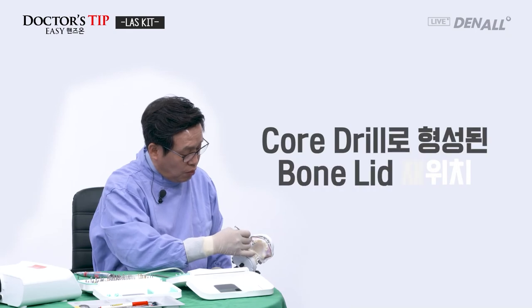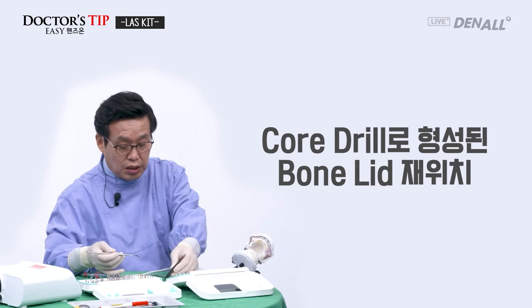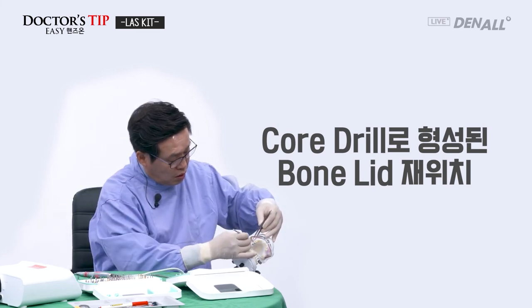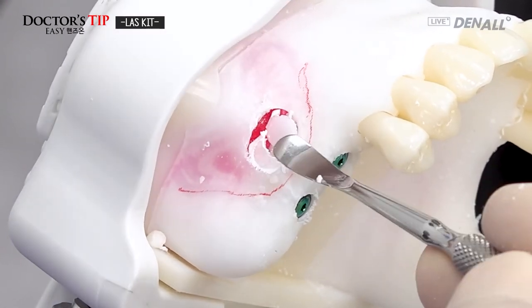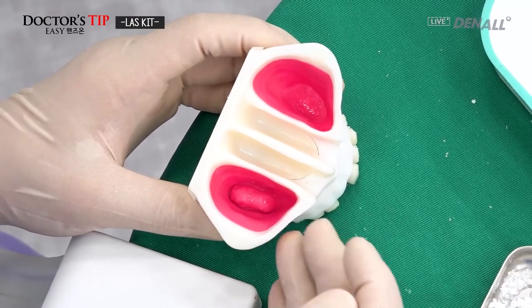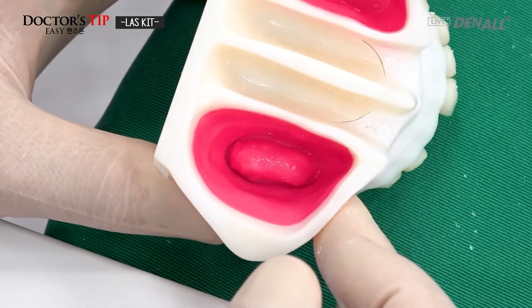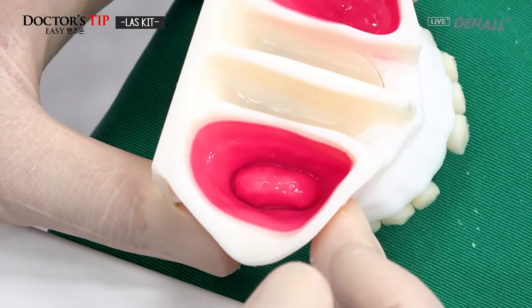And because we use core drill, there is a bone lid that's been detached. So we bring the bone lid back into position. So like this. Then surgery is complete. And as you can see here, bone graft material is all in there, bone grafting is done, the implant is placed, and the sinus is fully elevated.